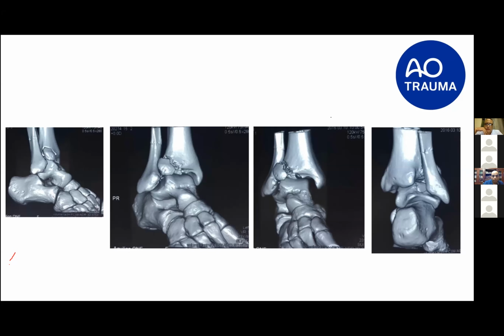The deltoid ligament needs to be fixed. I may need some bone graft here for this comminution to make impaction here, and I may fix it with a screw and washer, a large washer. And finally, at the end of the day, I have to assess here the medial clear space. If there is still medial instability, I will do a medial ligament repair.